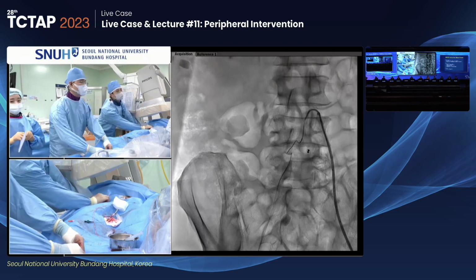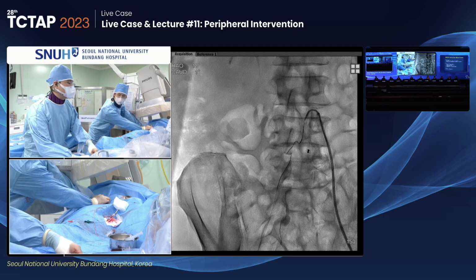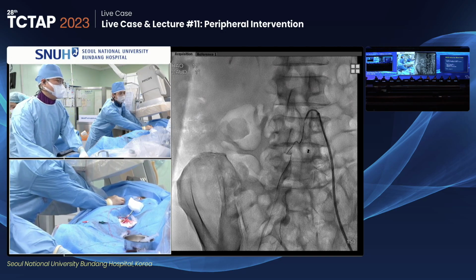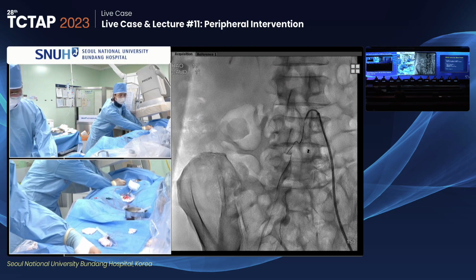This is a lot of pressure for a first-year interventional cardiologist. It's a lot of pressure for a 25-year experienced cardiologist. But Dr. Kim is a very strong guy.